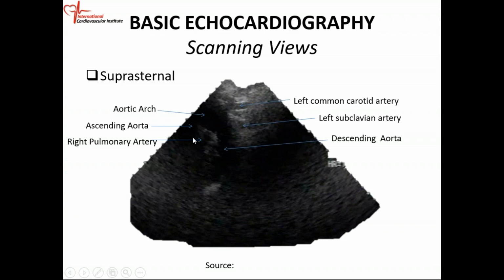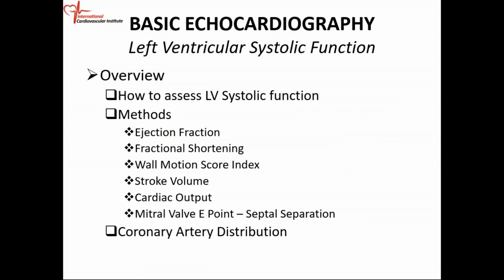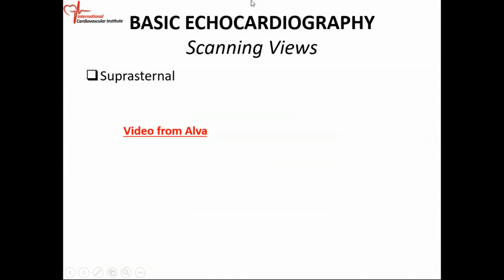This is your right pulmonary artery. So just below your aortic arch, you have the right pulmonary artery. Okay. All right. So that concludes your scanning view. If you guys want me to play a video of the whole thing, I can do that.